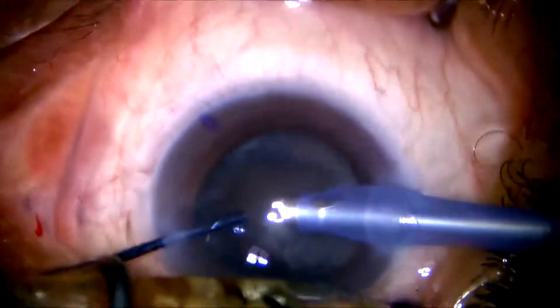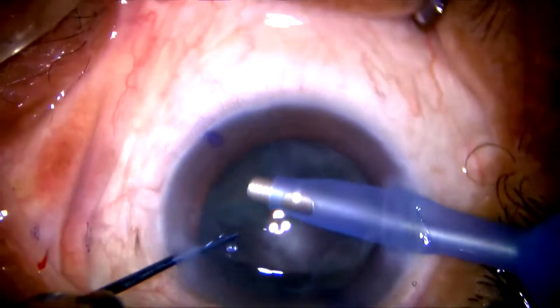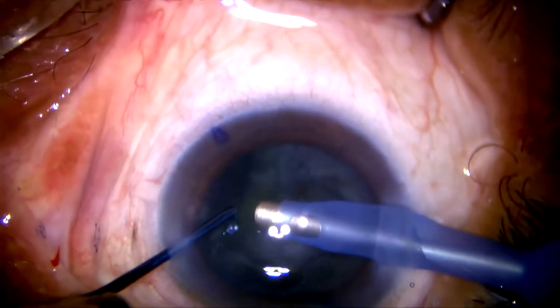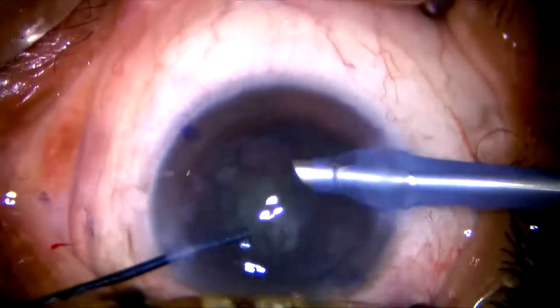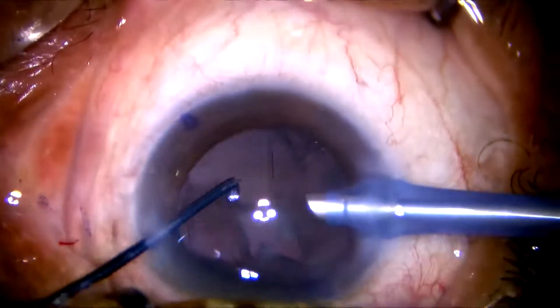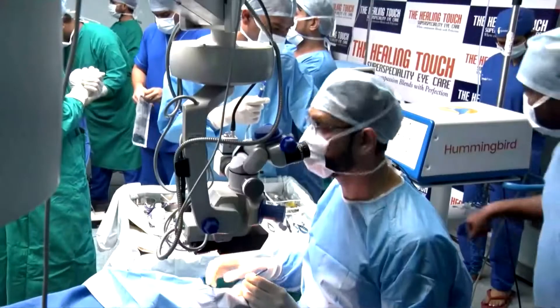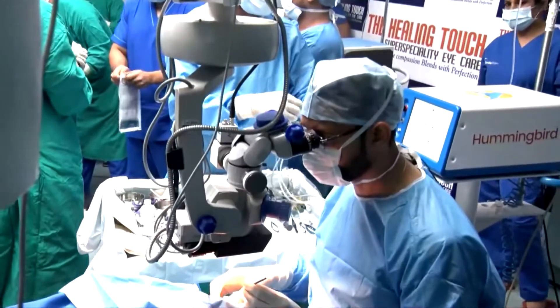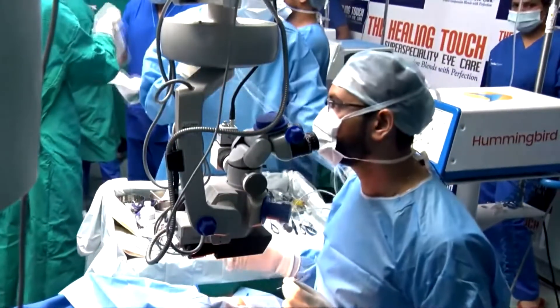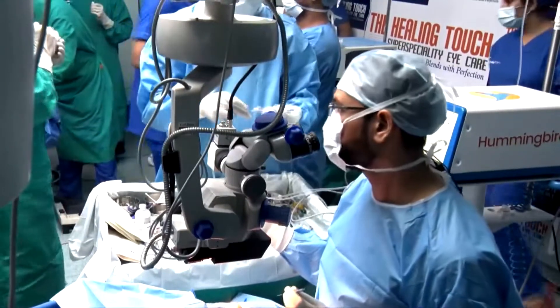Can we have the interface of the phaco machine on screen? The audience may like to see that. You can see the chamber stability in this machine is excellent. The hold is also quite good, and this machine has a very good stroke length of around 120 microns, which is helping in cutting down the nucleus softly and gently.